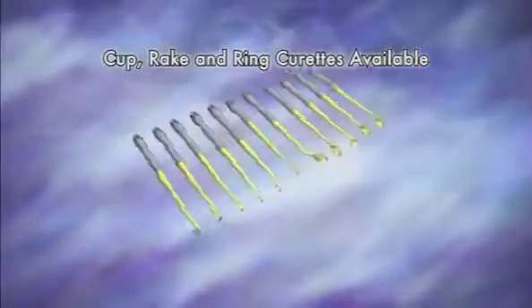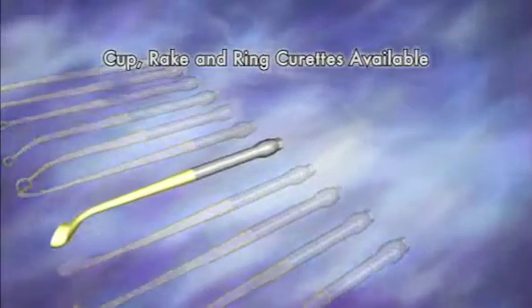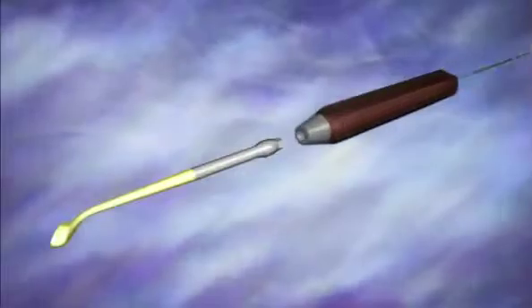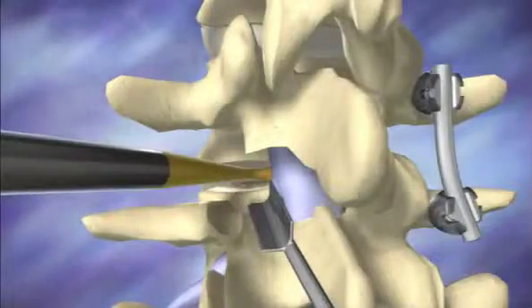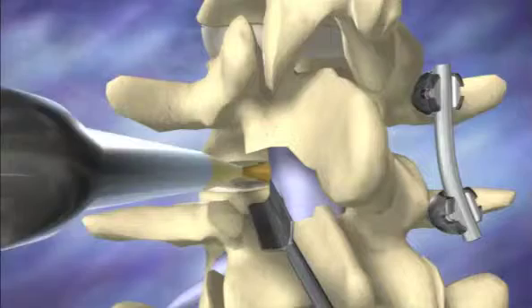The system incorporates specialized spinal instruments, including curettes in cup, rake, and ring shape. The connector shaft screws into the proximal end of the modular handle, engaging the curette, which fits into the distal end of the handle. These curettes aid in the removal of bony and cartilaginous end plate tissue.